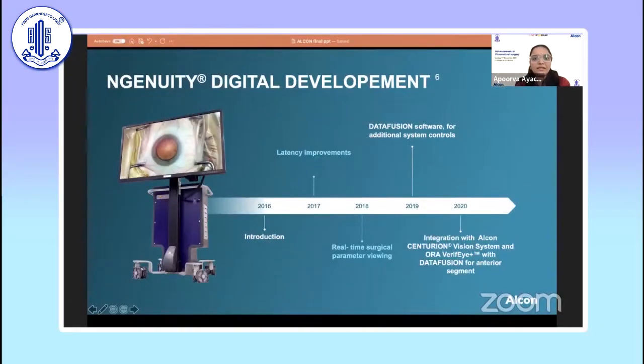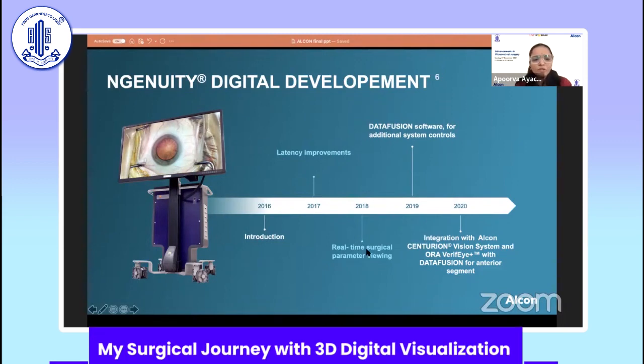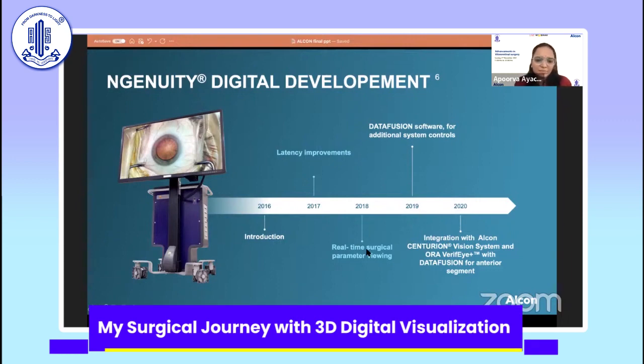And then a giant wow factor entered our VR surgical circles, when the Ingenuity came in, in 2016. In 2017, I believe they improved the latency issues a bit, especially for the anterior segment. Since we were one of the first users of Ingenuity in the country, we almost could not use it for anterior segment surgeries because of such a lag, and then they started improving it. For the posterior segment surgeries, we've never experienced any lag. It has always been wonderful.